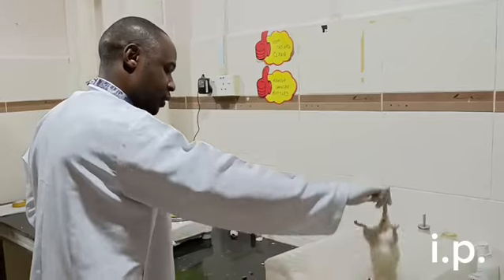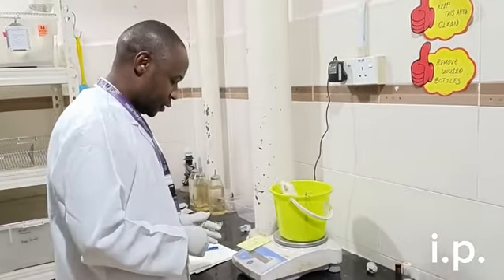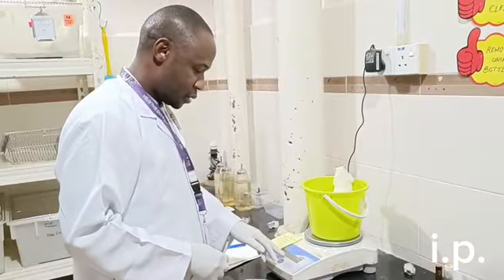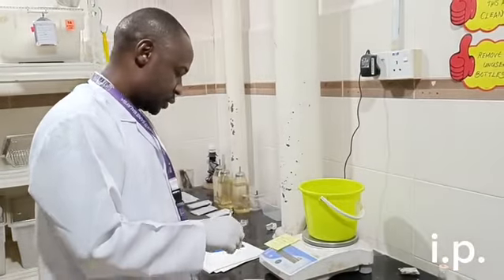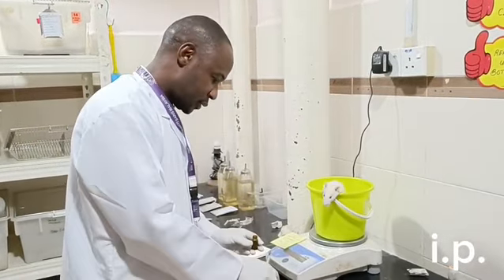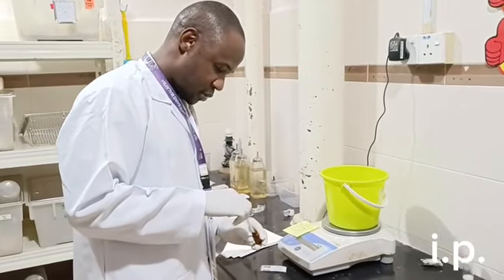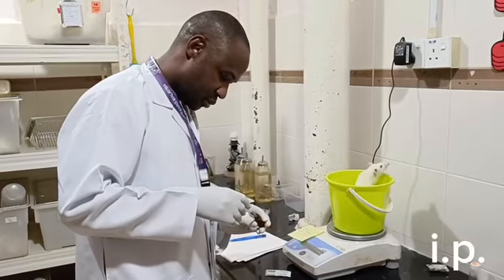So you need to take the weight of the rat. See, this rat is weighing 363 gram. So you take 0.363 ml.